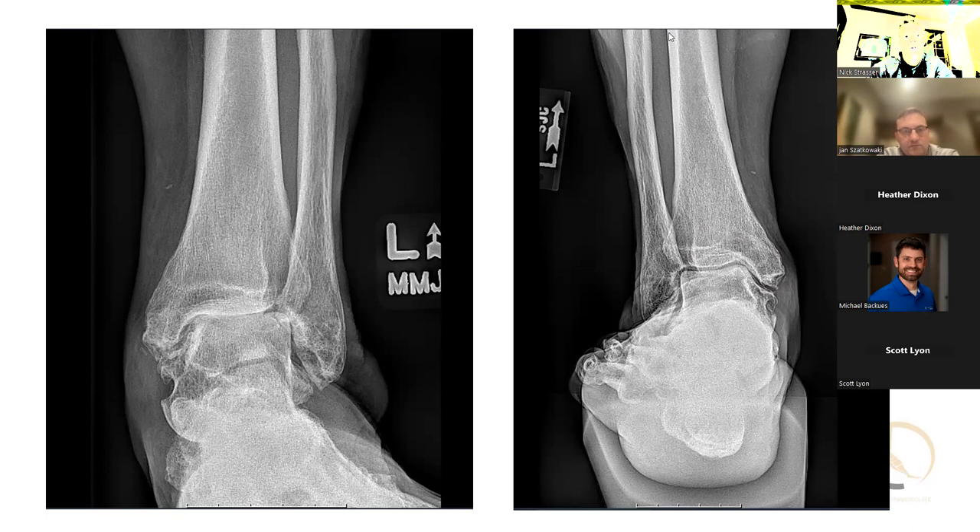I agree — somebody with a flat foot and ankle arthritis makes me a lot more nervous than somebody with cavus feet and ankle arthritis. The flat foot, I feel like I've gotten into some very challenging situations with the deltoid. For those who may not know, this is a Salzman view — we're trying to line up an axial view to see the weight-bearing axis of the tibia. You can see the heel sits in a little bit of valgus, with the mechanical axis line sitting a little more medial than ideal.